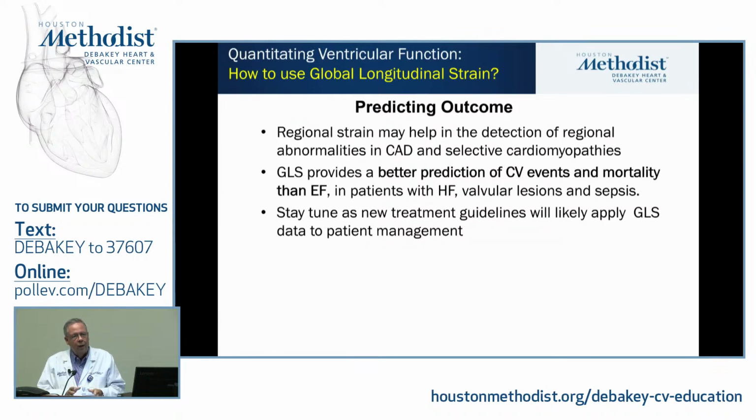But certainly when we're dealing with people that do have diseases, HFpEF, valvular diseases, the data now is quite strong to say that the strain is a better predictor of outcomes. And therefore, I think we will, in the next few years, start seeing these penetrate guidelines. I wouldn't be surprised if we see some recommendations in the guidelines, particularly for valvular heart disease, but even perhaps for HFpEF.